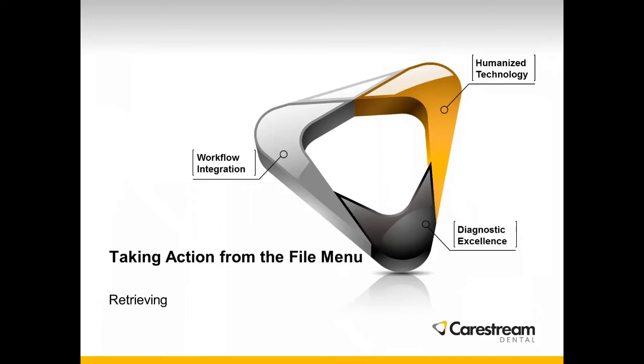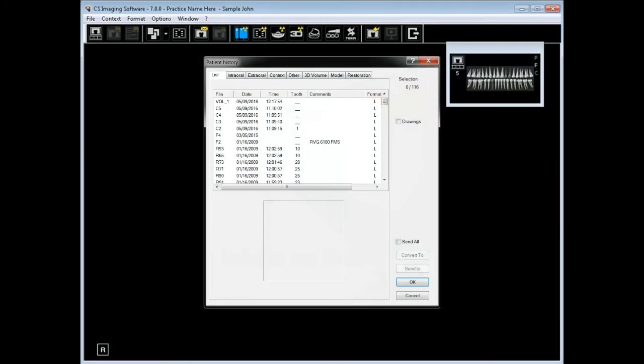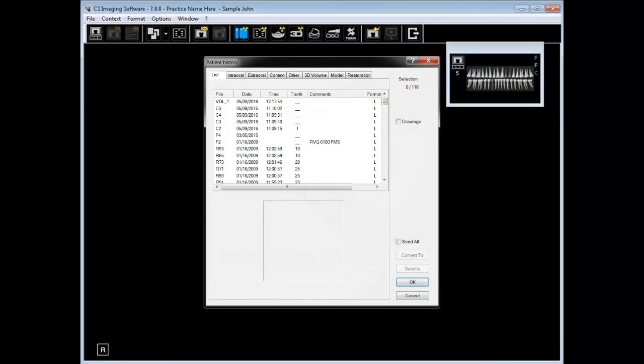Taking action from the file menu to retrieve an image. The patient history window lists all images for the current patient. To open the patient history, you can click file history open or you can click history open the first icon on the main toolbar.